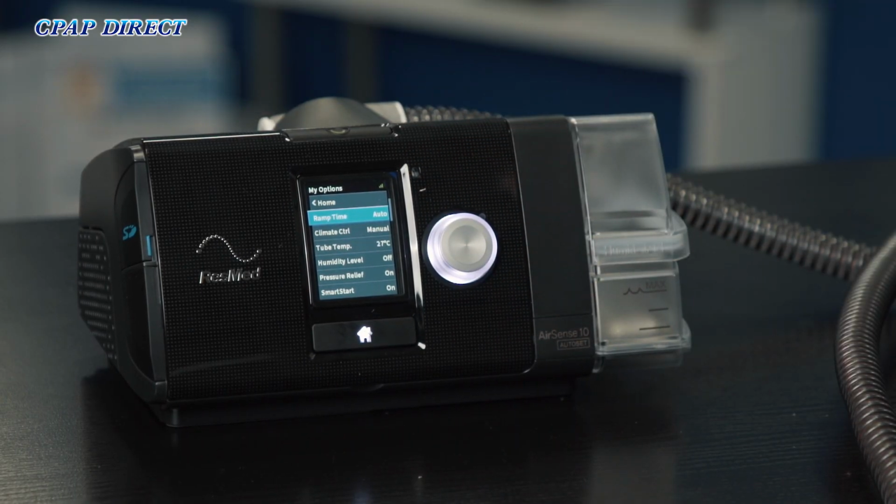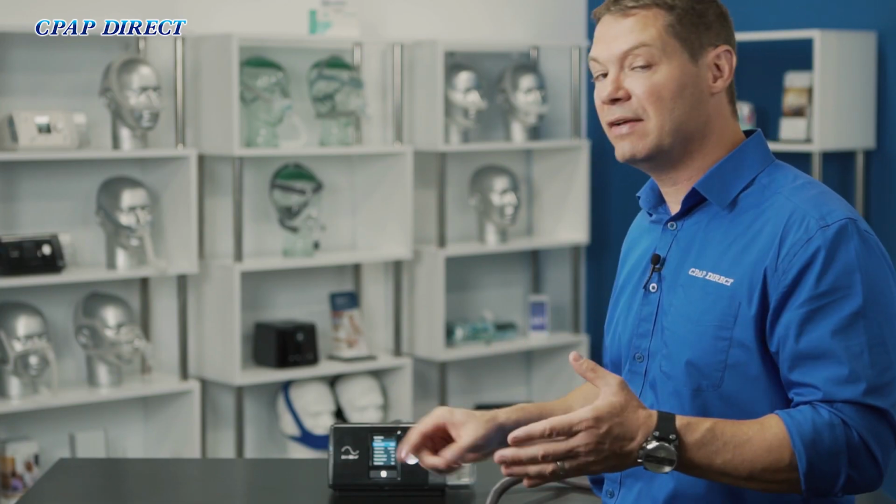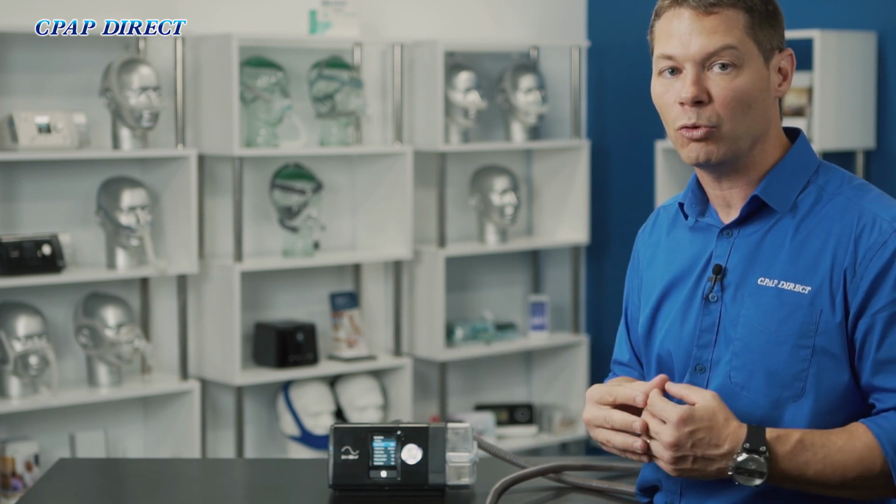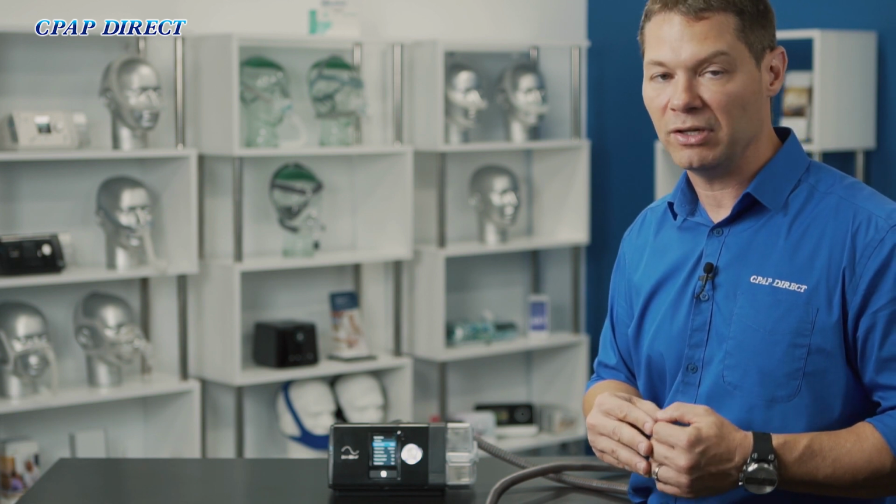As we scroll up to the very top of the menu, we have a ramp feature, which is really not used for automatic devices, but if you have a fixed pressure machine and you want the machine to start at a lower level before it gets to its therapy pressure, then you can leave it on automatic. This will wait till either you go to sleep or half an hour goes by before it starts getting off that start pressure to climb up to the therapy pressure. As I said, on an automatic machine, you don't really need to have a ramp set because we have a floor and a ceiling pressure, and the machine will work within those parameters from when you first start.